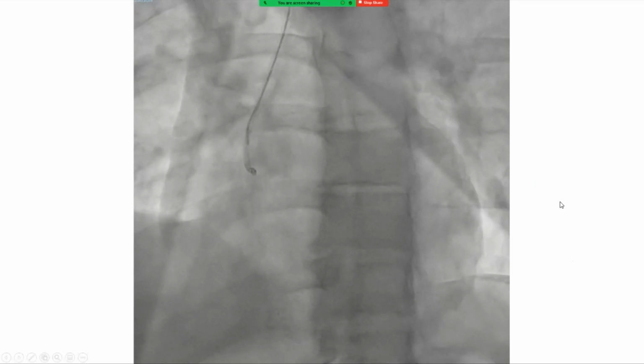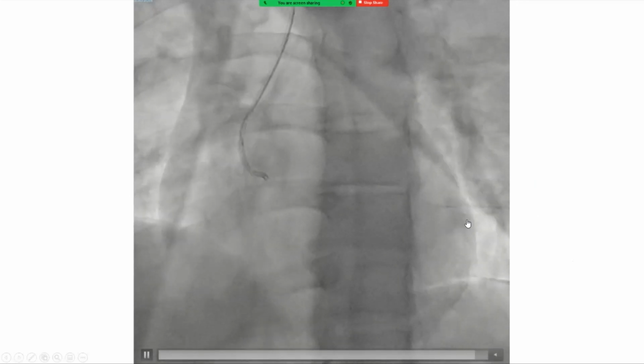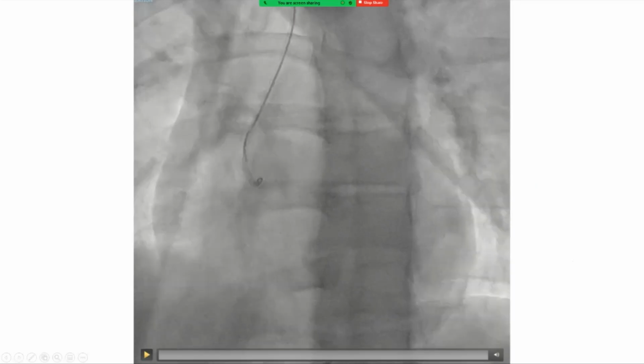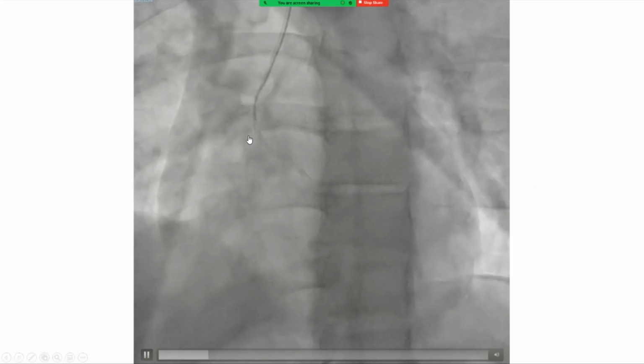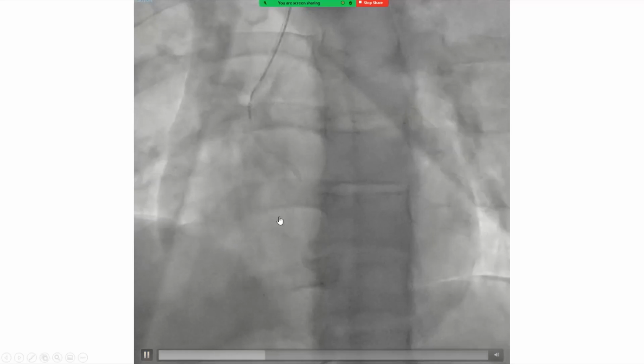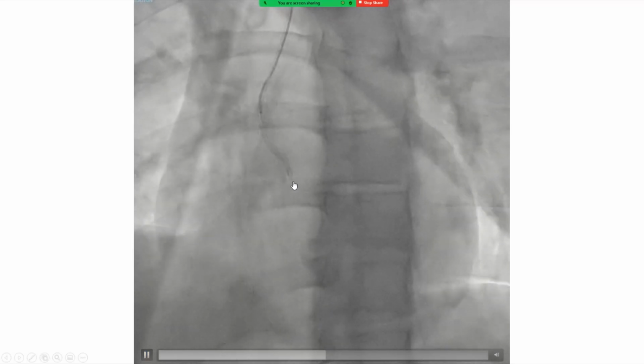So what you do when this happens, you start over. You pull on your catheter to free it, and this is what was done here. So you pull on the catheter to free it, and now you have it elongated with a free tip. Now the tip is free. If it is not free, you need to pull a little bit above the cusp, make it free and elongated. And now you start clocking.